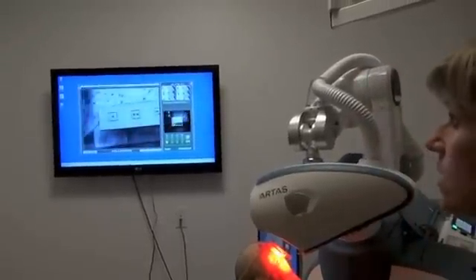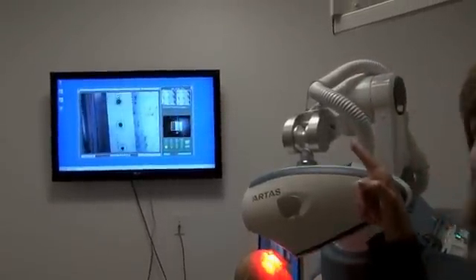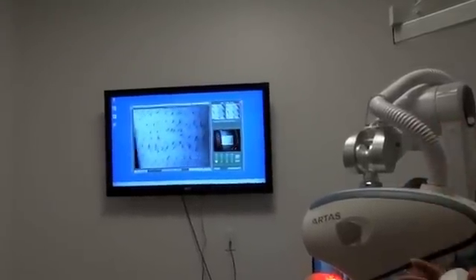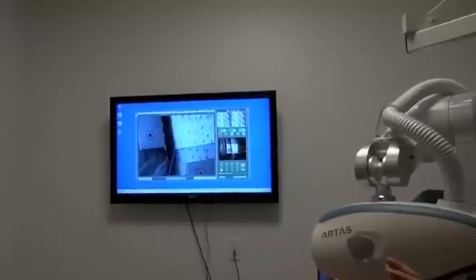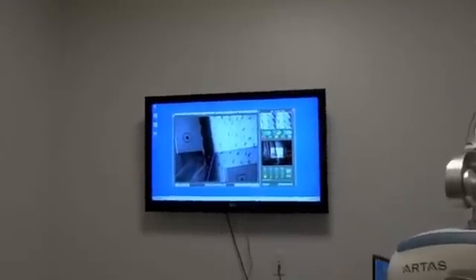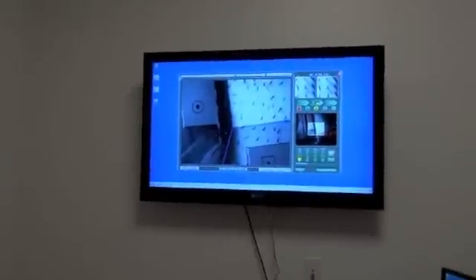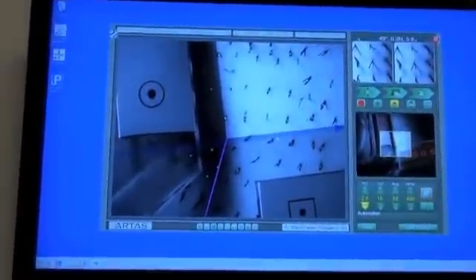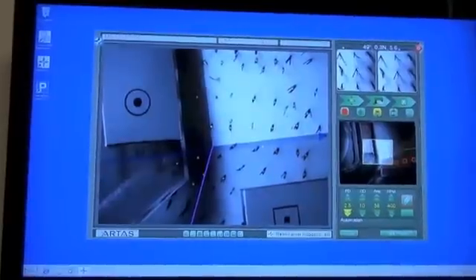What you're seeing now is the system moving. If you look at the screen, you'll see how it goes around, gets in the middle of the work field, and measures the hair density. Each area that the system is working in will measure the hair density, and it knows how to line itself up on the bottom of the work area.